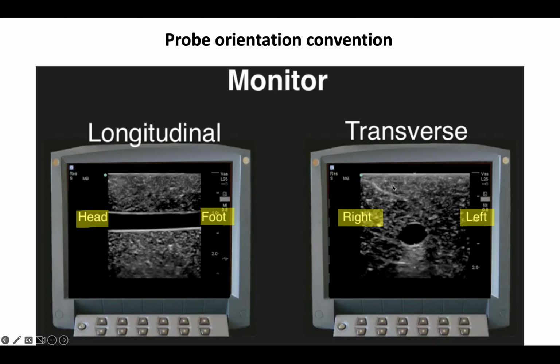While if the transducer is oriented transversely, then the orientation marker on the transducer is toward the patient's right, or I usually use it toward my left because I'm facing the screen.